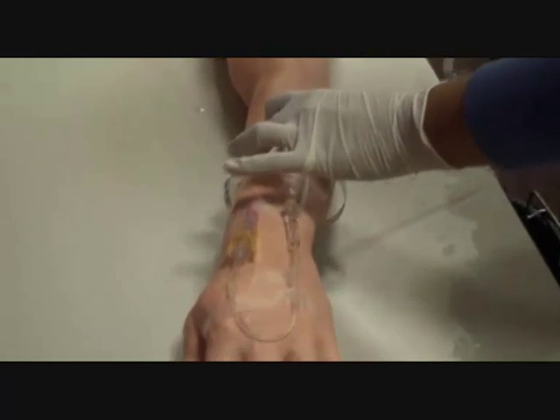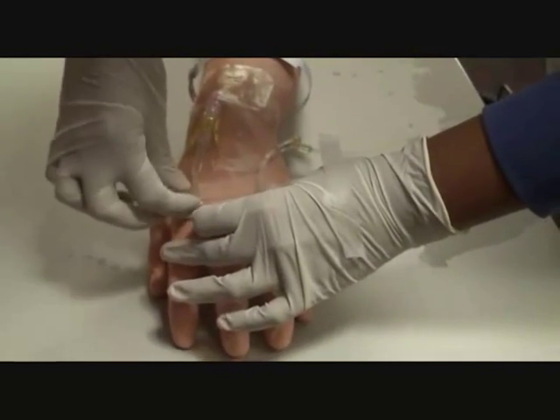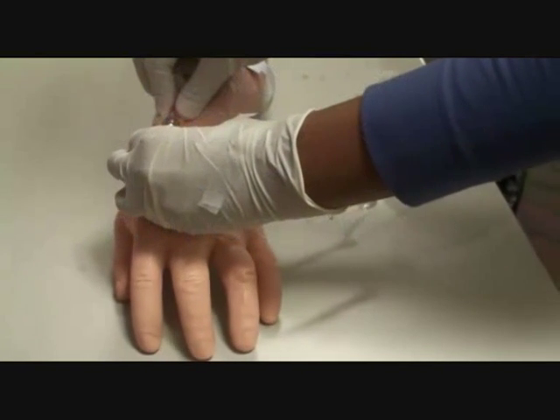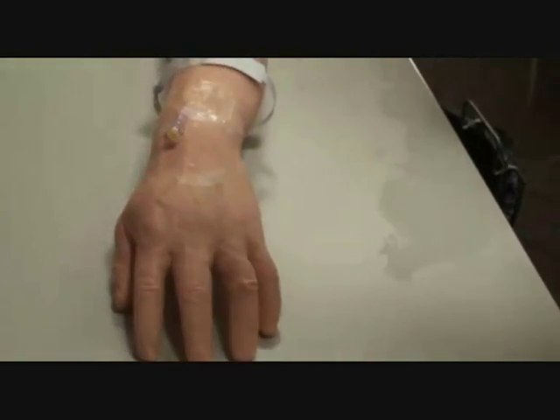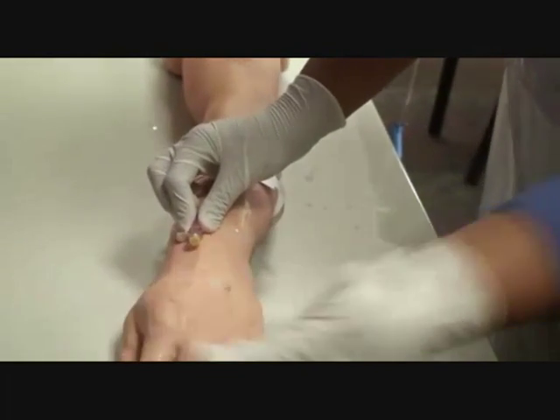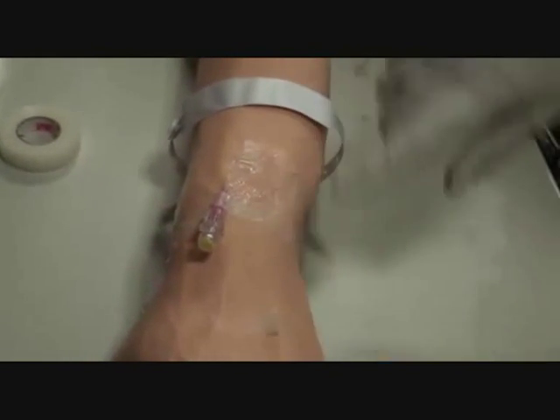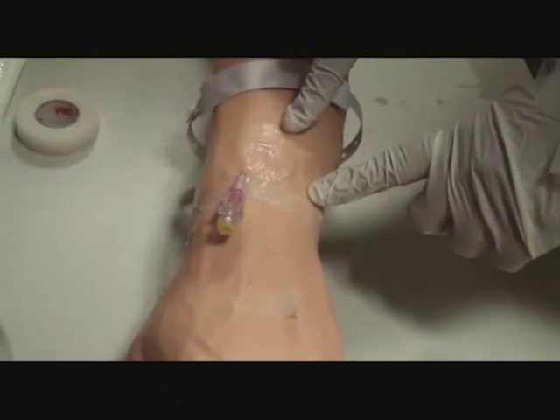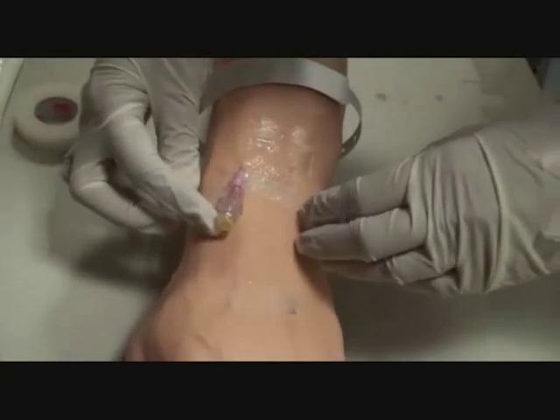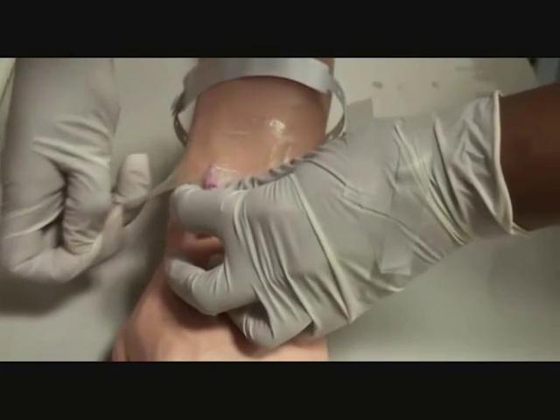Tape off. If I was just going to change the line, I'd take that one out and put my new one in. Now that I've removed the line, inspecting the cannula site for signs of infection or leakage — and there's none. I need to remove the tape as best I can.